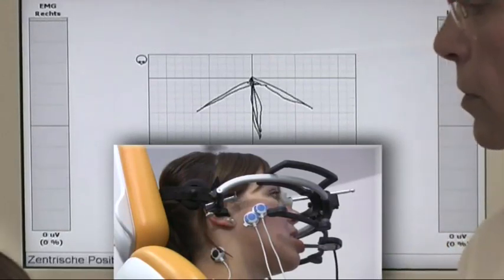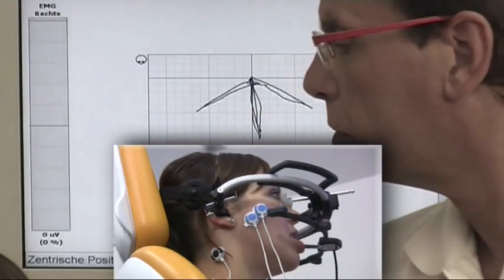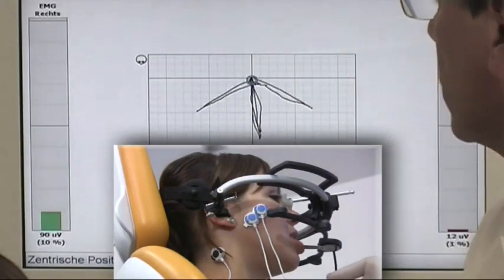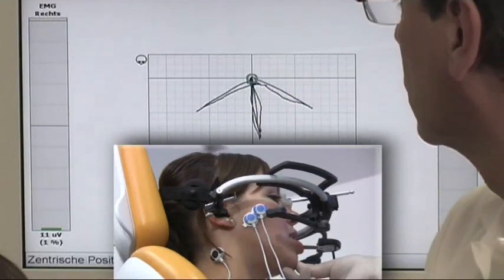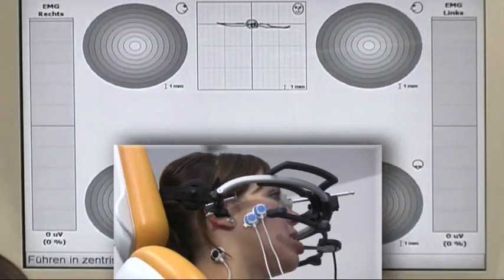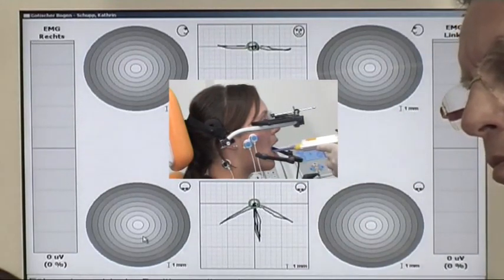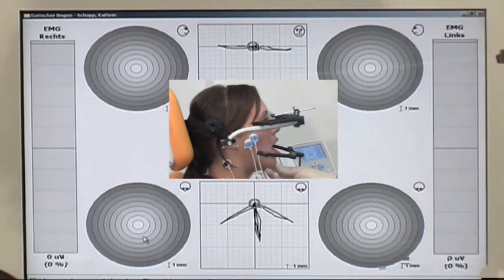Now we have to adjust to the centric position. A little bit forward and then back. That is our target position for the centric registration, and we can now start to produce it. The registration material is applied to the dentition. The patient closes once more.